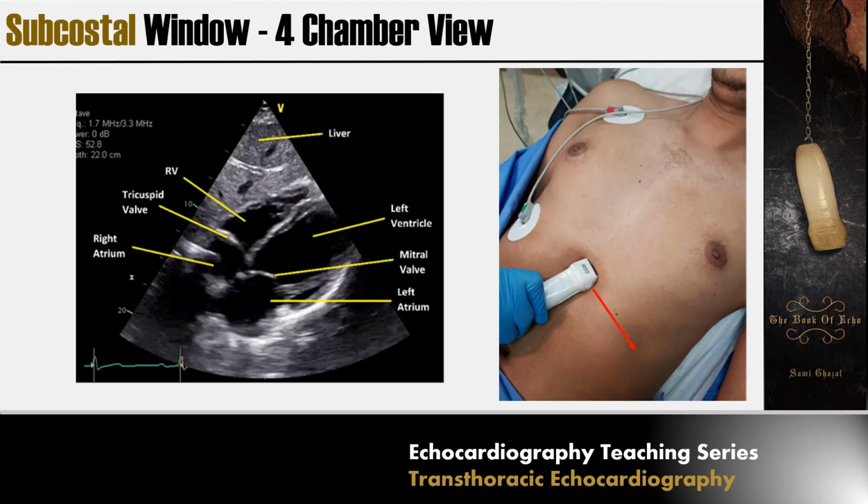Moving to the subcostal window. In subcostal window, multiple views can be obtained, and usually the first view to be obtained is the four-chamber view.